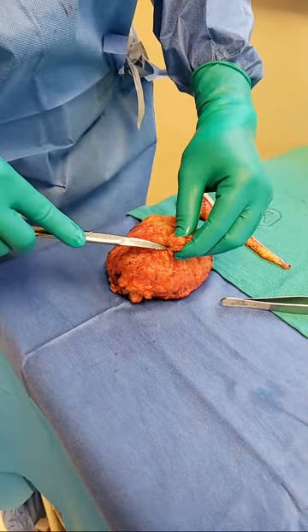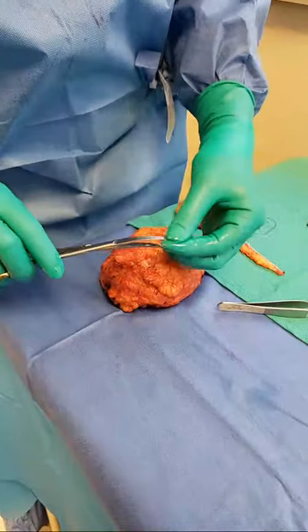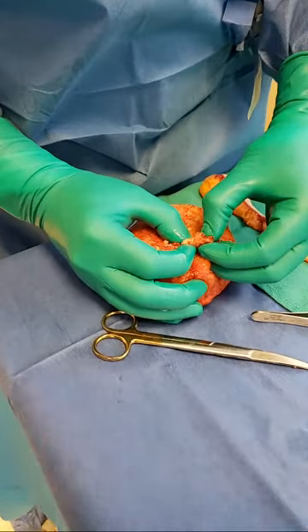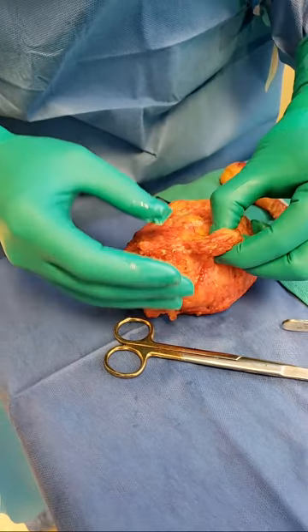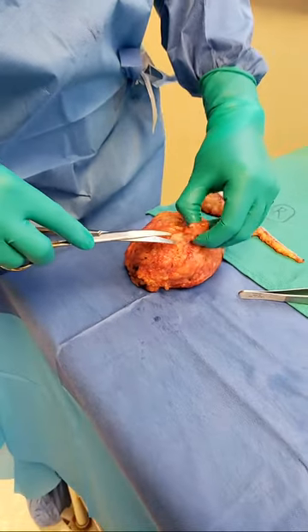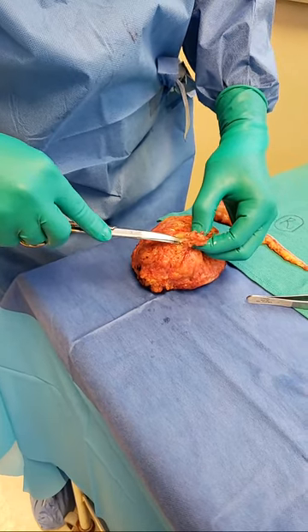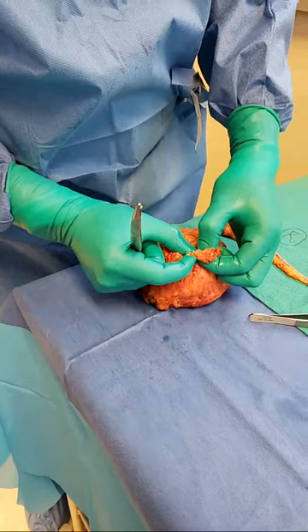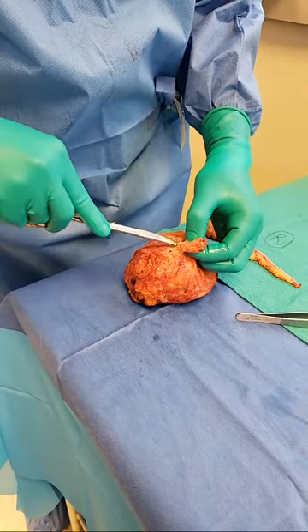I'm going to go here just for completeness. Look at that — some more of that. I'm popping a pimple. So as I go like this, this is all badness because I can feel, having been in the operating room since 1998, I can tell just by touching and seeing — sixth sense certainly — what tissue is good and what tissue is bad. It's like an acne pimple.